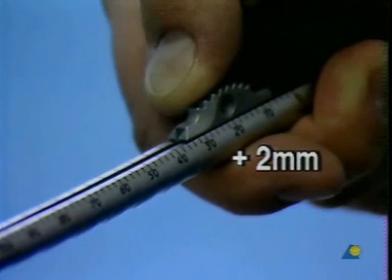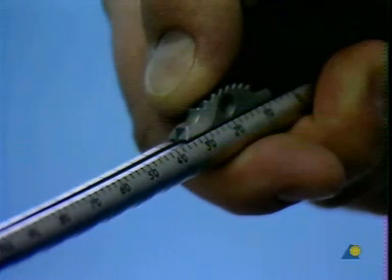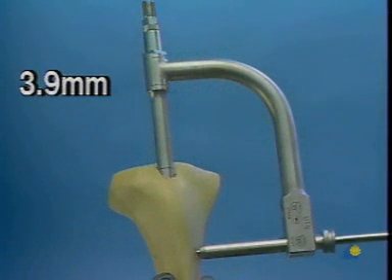To ensure that the self-cutting trocar tips of the locking bolt penetrate the far cortex, we need to add 2 millimeters to the measured length. After insertion of the locking bolt, the tissue protector is removed.